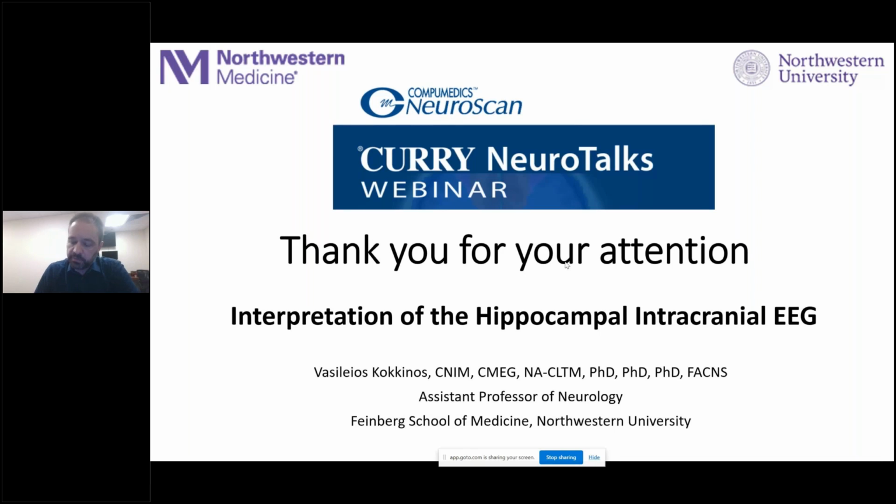For example, a very well described syndrome is that of mesiotemporal lobe epilepsy, and we have more than 70 years of good understanding of this syndrome and how it manifests. In that respect, even now we have a pretty standard way of implanting patients that we understand are more likely suffering from this syndrome.